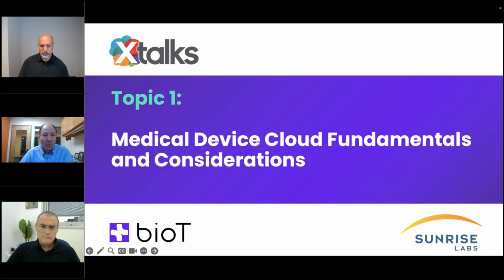Getting an actionable answer might be really enhanced by being connected, having more processing power up in the cloud, having more inputs that you don't have from a hospital information system, maybe in a classifier. So there can be some real advantages, but there's also the opposite side of it, which is you don't want to flood them with data. So you might want to simplify the whole thing.